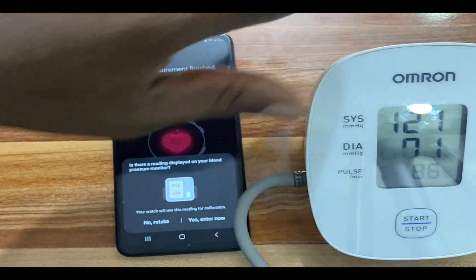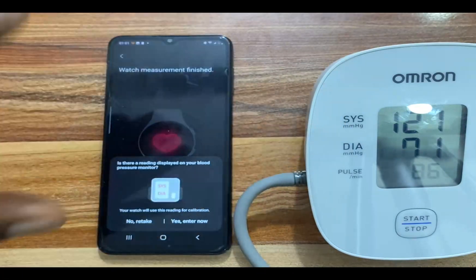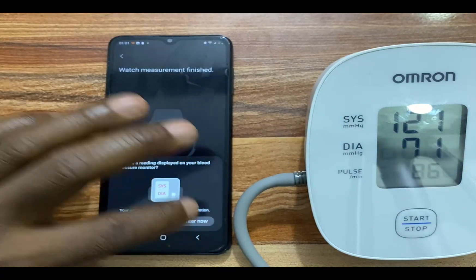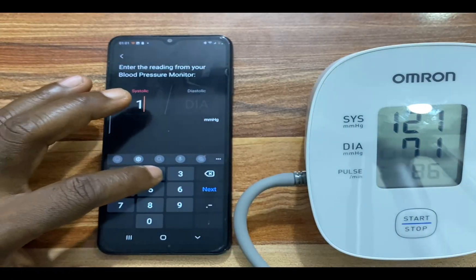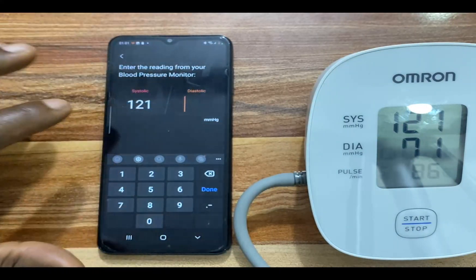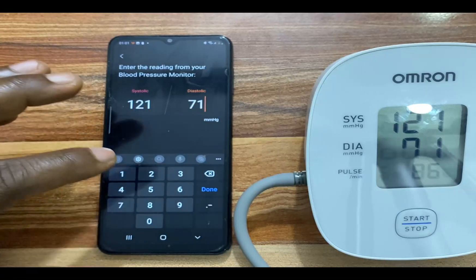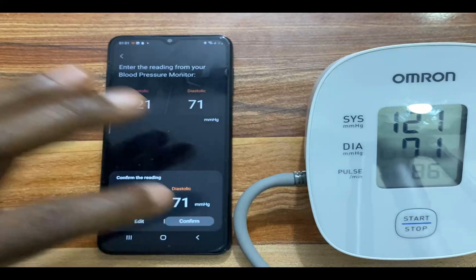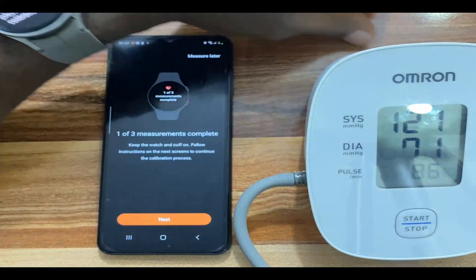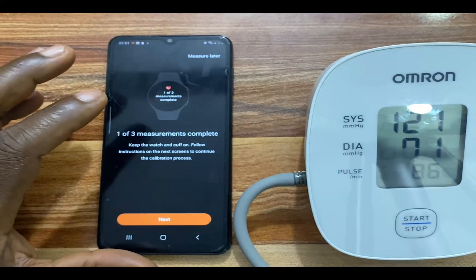Here we go — we have the first measurement. Tap on Yes, Enter Now. We have the systolic as 121 and diastolic is 71. I am going to tap on Done and confirm this. That is the first measurement, and we need to take two more.